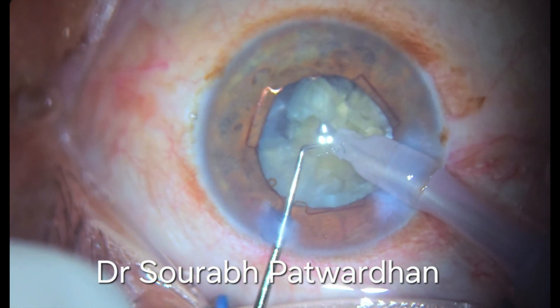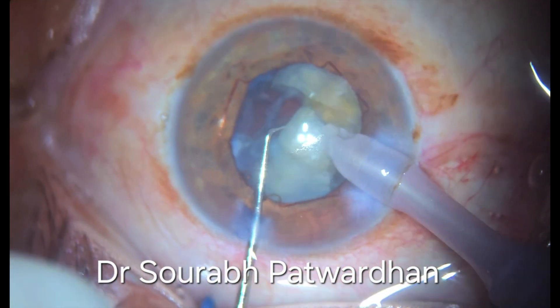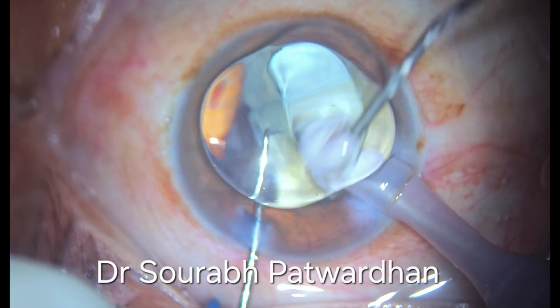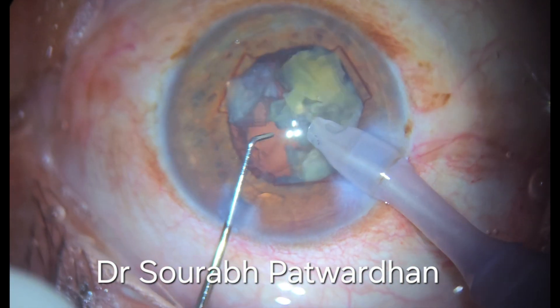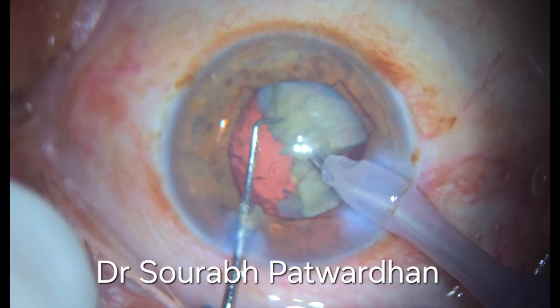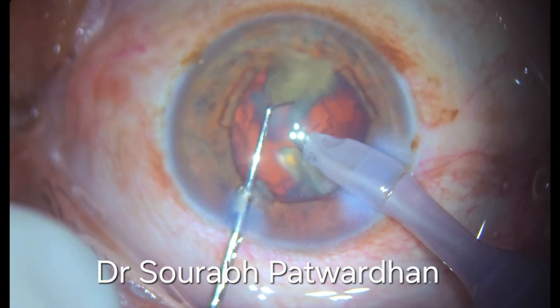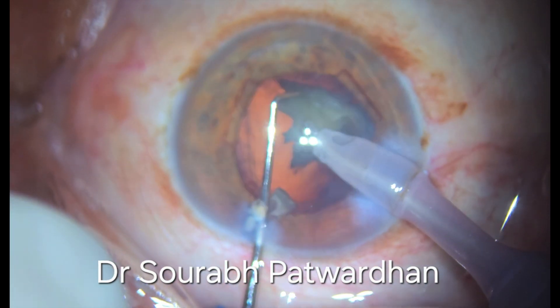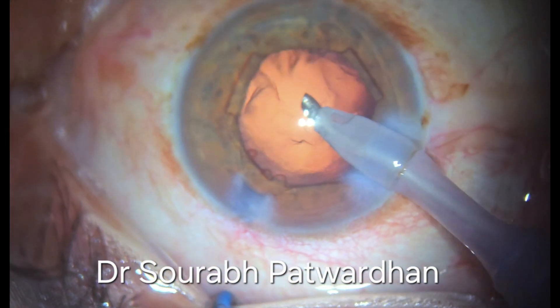Use of heavy dispersive OVD like Hylucote helps in protection of the endothelium. At the same time you can see that I am pulling one piece at a time, so that emulsification happens completely for one piece before I go ahead with the other pieces. This avoids any flying pieces in the anterior chamber. The pieces should be free from each other — that is important when you are doing the chopping. If they are stuck to each other, quadrant removal takes longer time, and there is always a higher risk of complication.